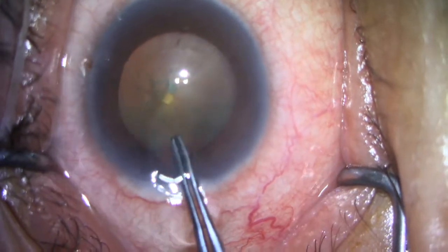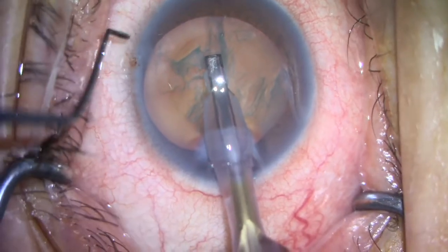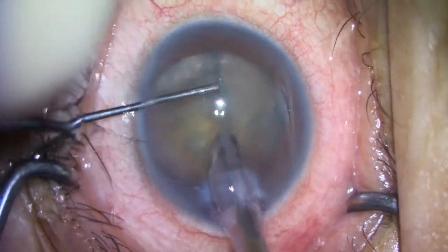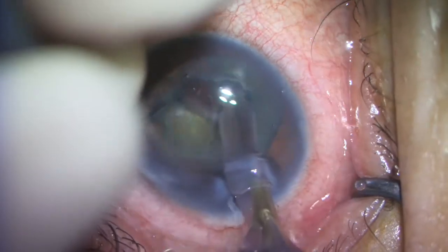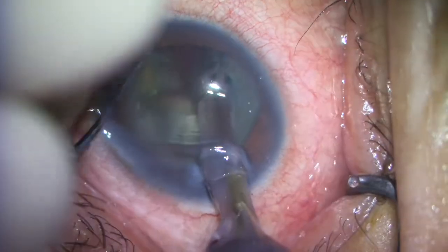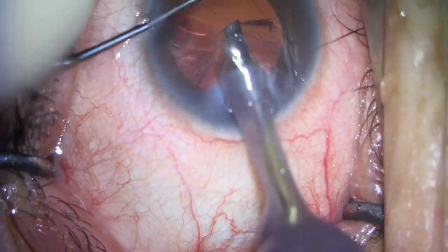Here I'm completing my capsulorhexis using Utrata forceps. I have the eye filled with NuVisc for my viscoelastic. I use a simple phaco-chop technique, with minimal phaco power used to sculpt a small groove, and then I fracture the nucleus into many pieces using my Sibell chopper.